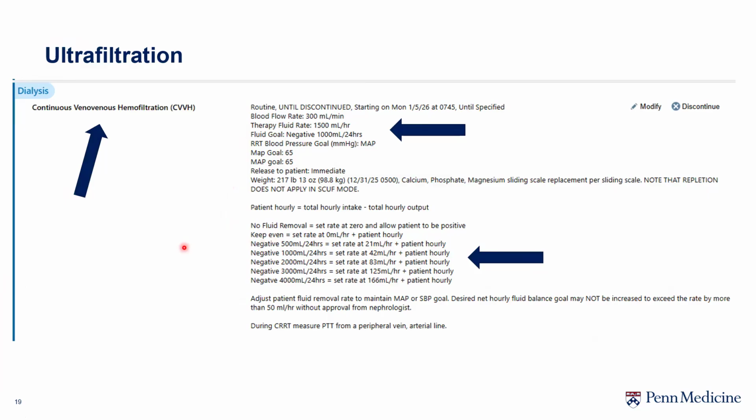Now, removing fluid will actually affect your blood pressure. So if too much fluid is being removed, the blood pressure may be affected. And in this case, you may want to come down on the fluid removal, but also you really should anticipate using pressors because it's really important to meet that fluid goal for most of these patients. And we can always take the pressors off after we're done UFing.